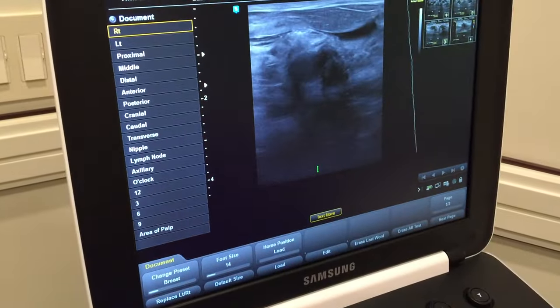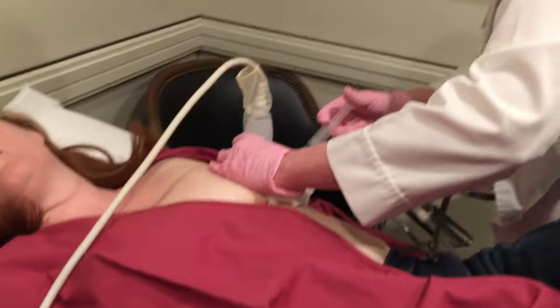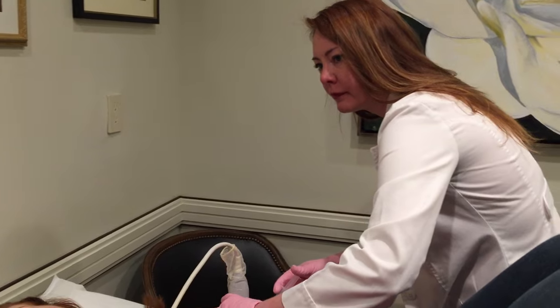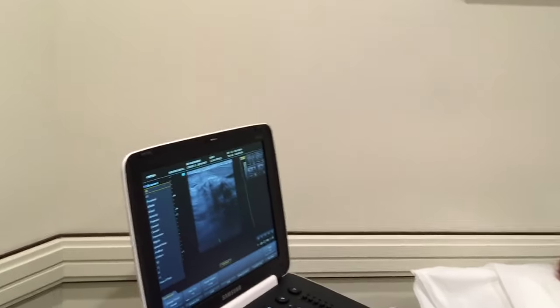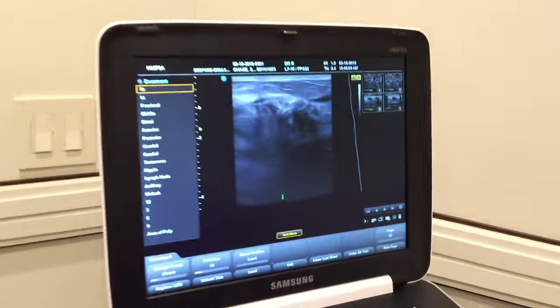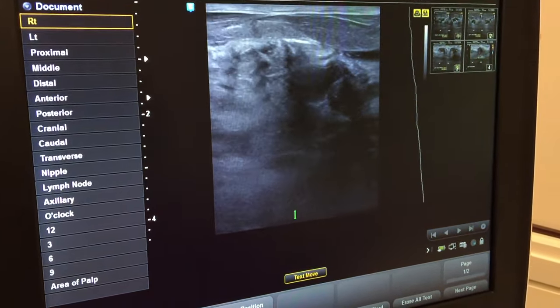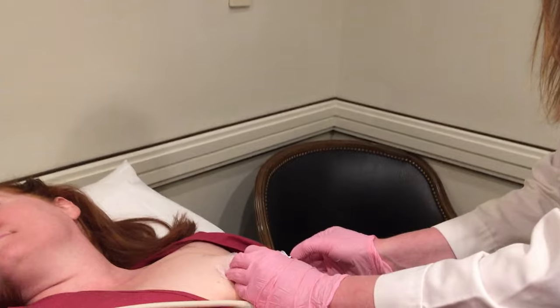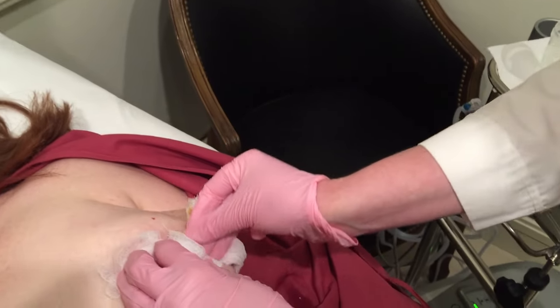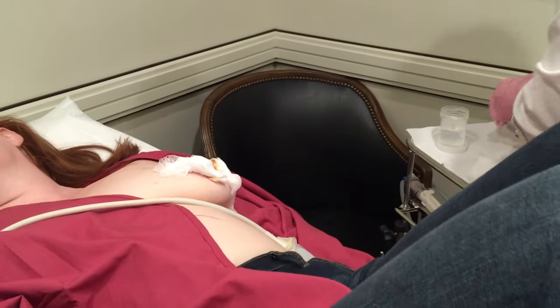Watching the screen with the ultrasound to make sure that we direct the numbing medicine all the way around the area so that it's completely pain-free when we go to remove it. The dark spot in the middle is the area that we're going to remove, and the movement you see around it is the numbing medicine. We like to hide the little nick right next to the edge of the colored circle so that there's no scar — it exists in a natural line where you have a line anyway, so it should be completely scarless when it heals.